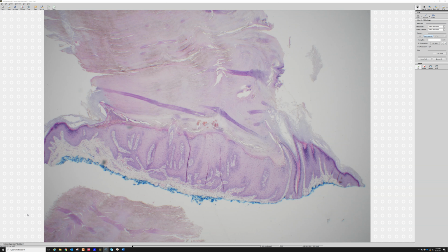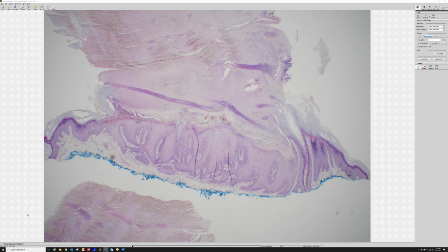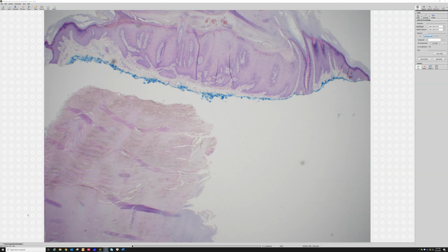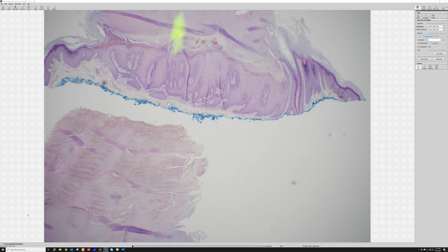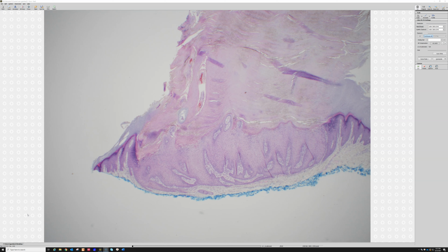And so the only way to know what's underneath a horn, and like I said, I'll put a link down below, and it's got some pretty dramatic clinical pictures. These look pretty wild sometimes clinically. But the only way to know is to biopsy and see what's underneath, what's growing all that keratin. So here what's growing in is a wart, and we can see the whole lesion here. They got a nice biopsy right under it. We can see all of the epidermis. You can see the nice rounded in-toeing of the rete at both edges. The papillomatosis here is not as dramatic as the other cases, right? So this again is why we go over the features.